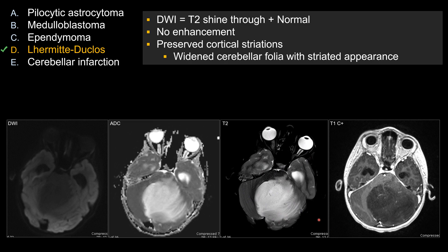Another key feature of Lhermitte-Duclos is that, despite the size of the lesion or the mass effect, you see lots of areas with preserved cortical striation — widened cerebellar folia with this preserved striated appearance. That would be a very strange appearance for other types of tumor, like pilocytic astrocytoma or medulloblastoma, which tend to completely take over and efface the cerebellar folia. So if you see lots of preservation of striation with a large lesion and mass effect, Lhermitte-Duclos is a pretty good bet.